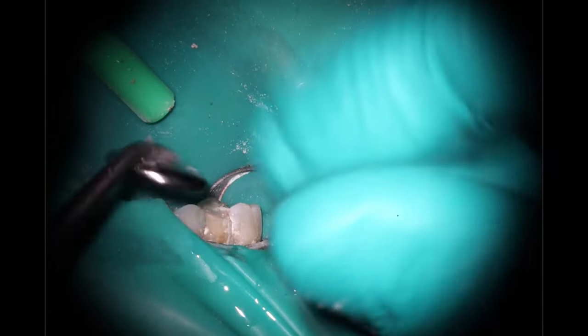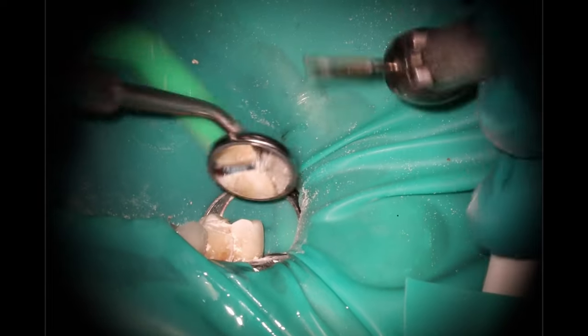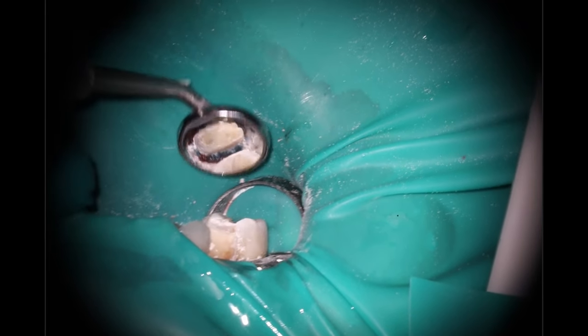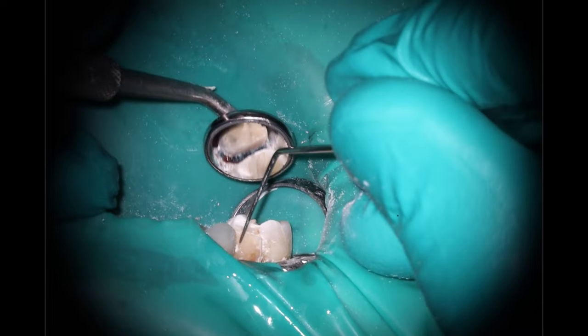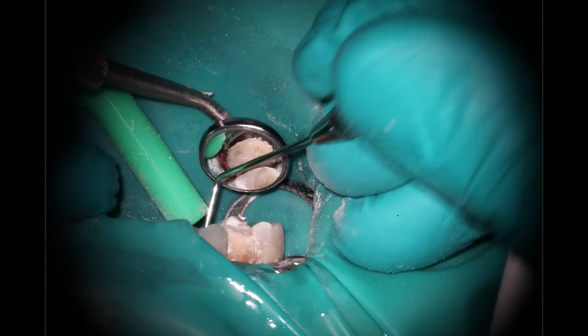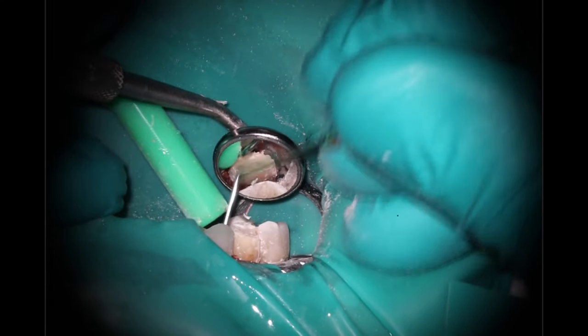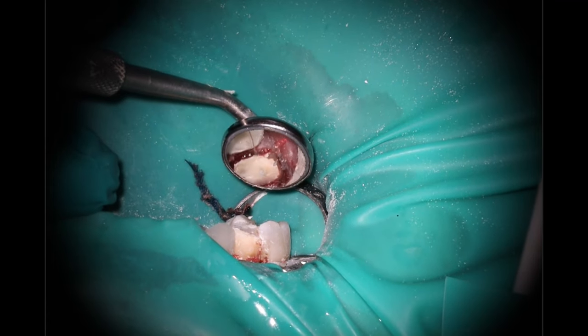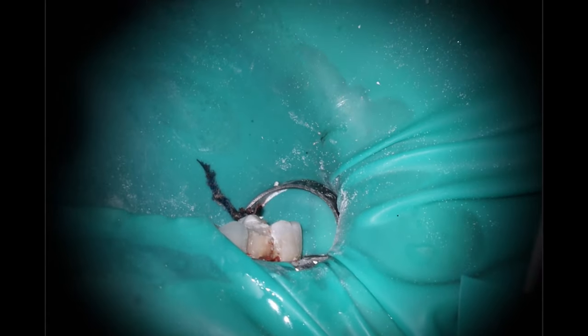Starting to do the buccal prep. I'm going to take the cord out at this point since I'm probably going to start ripping it out by accident. I usually do more of a direct vision for my buccal preparation, but the way her lip came up was pushing me out. So I decided to pull the cord while we have the rubber dam on, then remove the rubber dam and do the final prep. There will be a little bit of bleeding because the cord has been shoved into that area.